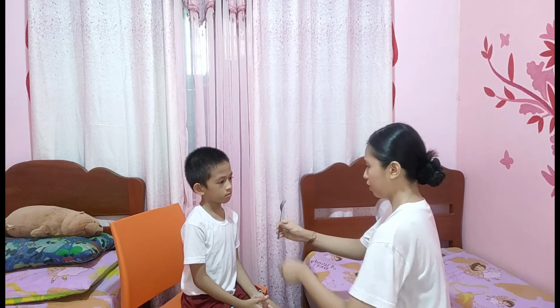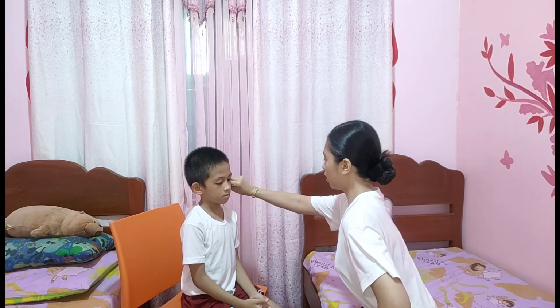Now on the other side, sir. It stopped. Okay. 16 seconds for bone conduction upon using the tuning fork.